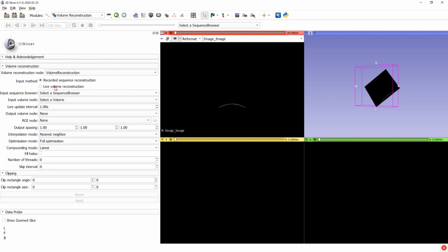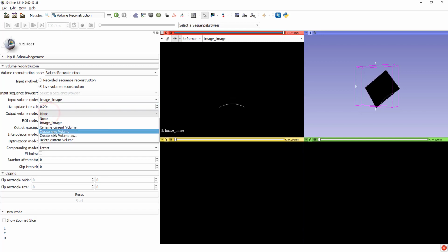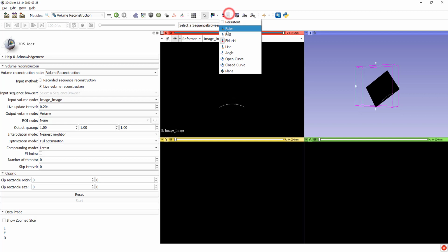Now we can switch to volume reconstruction module, select the live option. The input image will be our ultrasound image. And we will try a relatively fast 0.2 second interval for updates.